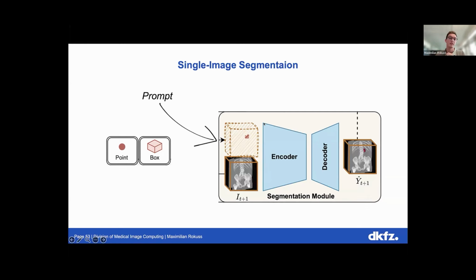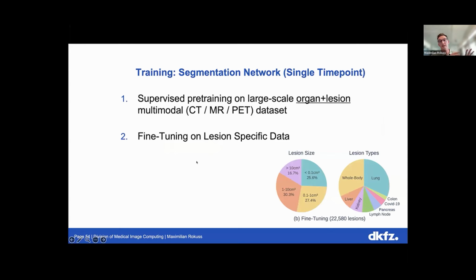And the big advantage here is that from the get-go, you already have the rough location of the prompt encoded in the volume, because you prompt at the same spot, so to say, as the lesion is in the medical image. And this, if you look at the data set now, has to be trained with a whole lot of images to really get it working. Even though we're doing early prompting, we still need lots of data to really make this work out of distribution.